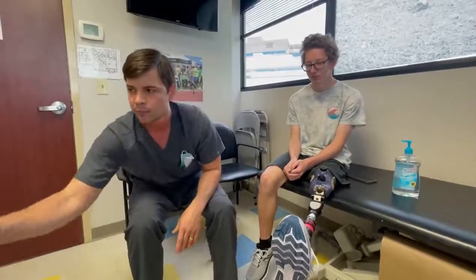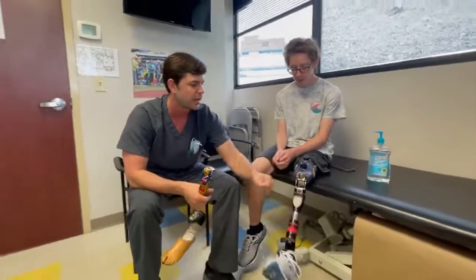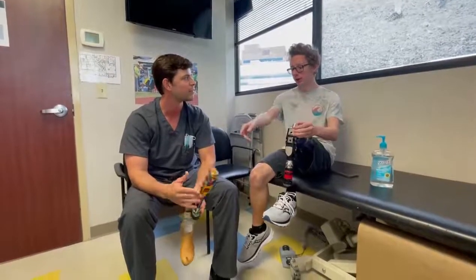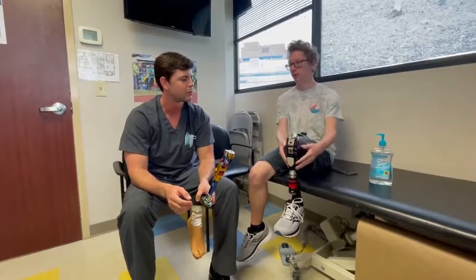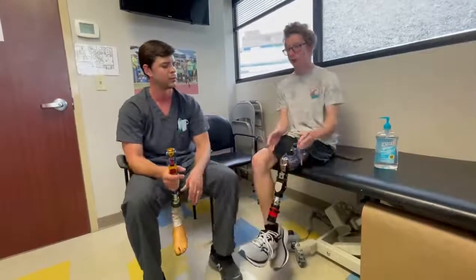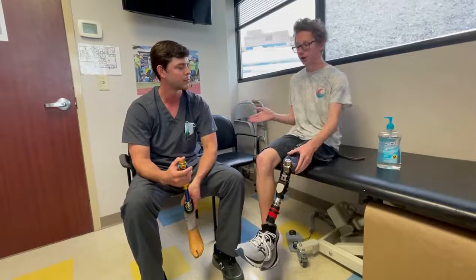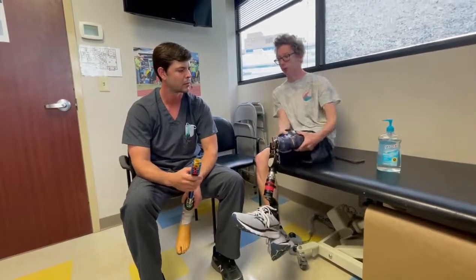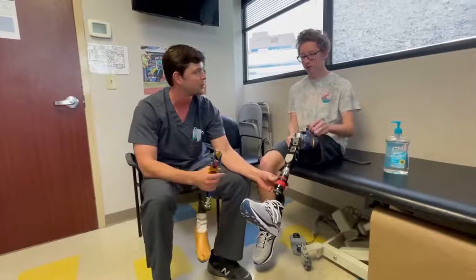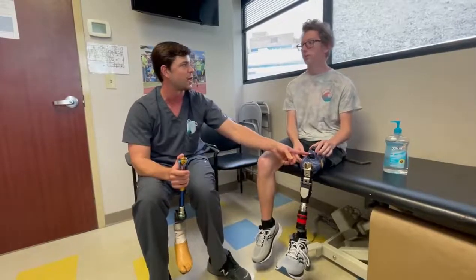Justin asks Aiden to compare the new knee and foot to the previous setup. Aiden says the new knee has more weight to it — when you push down you actually feel that weight when walking, whereas the old one just kicked out and back in. Regarding the torsion adapter, Aiden explains it acts more like a pivot when you walk and turn simultaneously, moving with you so that when you cut at an angle you get more compliance, and the socket itself doesn't have to absorb the rotation. He says he likes it and considers it a good change.